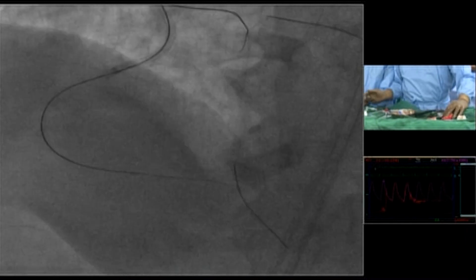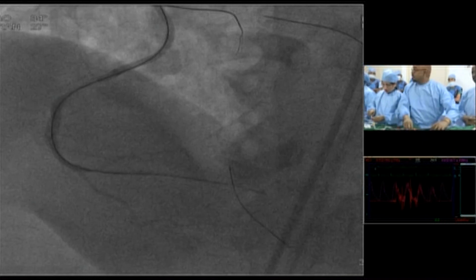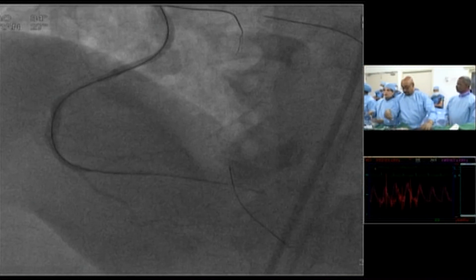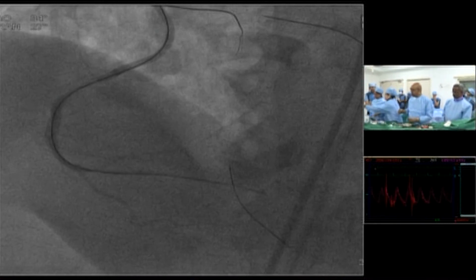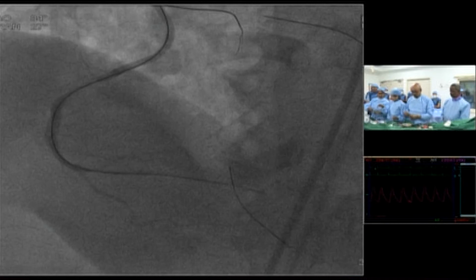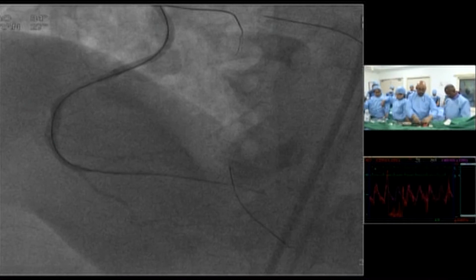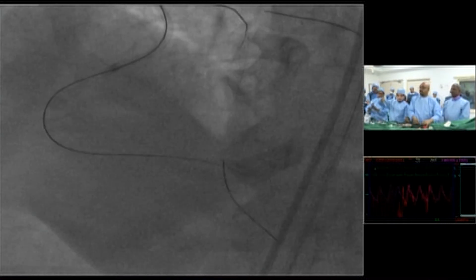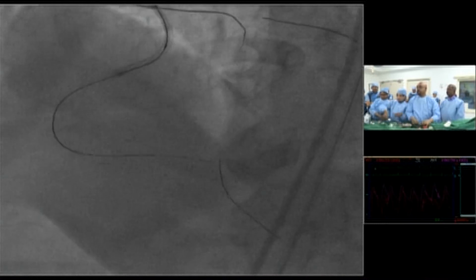Dr. Anand, thanks for selecting a very courageous case and excellent demonstration going on. But I was told that we have only about 3-4 minutes left. So we would stent the proximal RCA and take a picture and then reassess the distal status after nitroglycerin, and then probably you will decide. And then you would like to stent the LAD. That's the plan. Yes. So if you give me 2 minutes, I'll finish the RCA. Yeah, please go ahead. Just in case you break, I thought I'd mention. Okay. So the plan is to finish the RCA stenting and get back to LAD and stent that. Check.